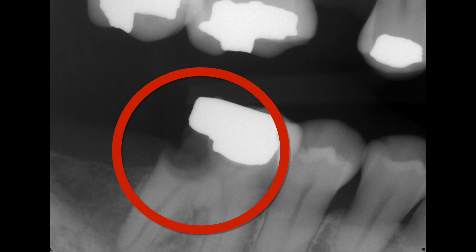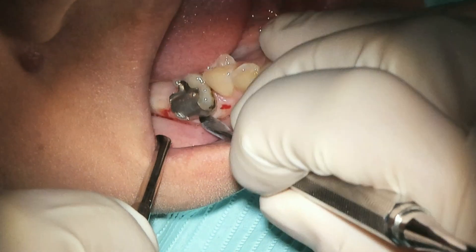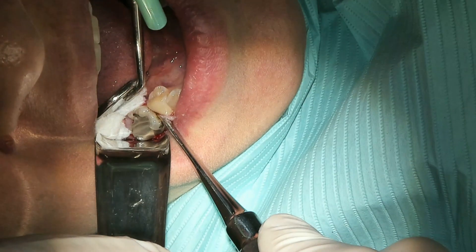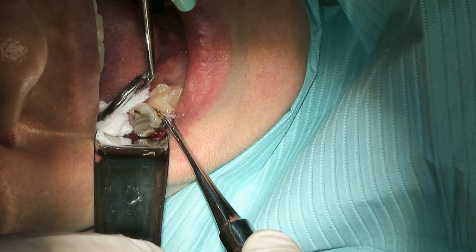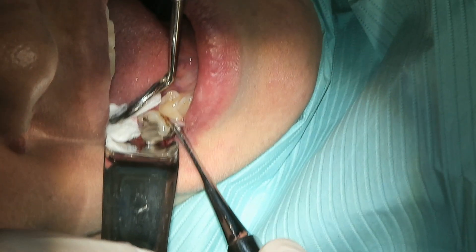Here we have an infected tooth reaching all the way to the apex as marked here. So first we go ahead and sever the gingival attachment and then we go ahead and start to elevate. We don't have to elevate too much — I notice a lot of movement already due to bone loss that has already occurred.